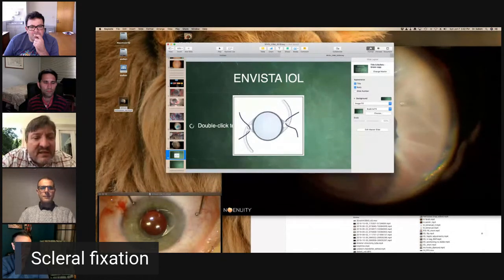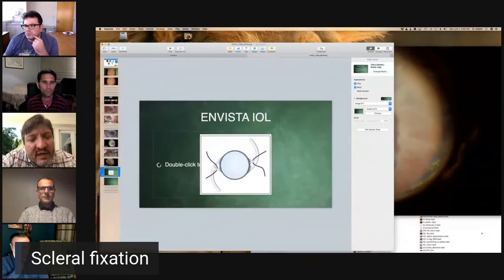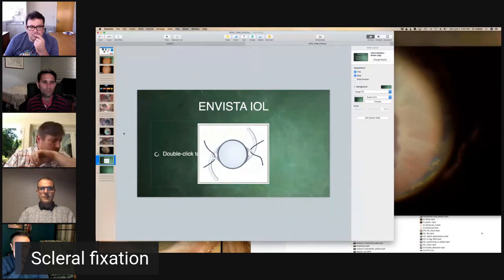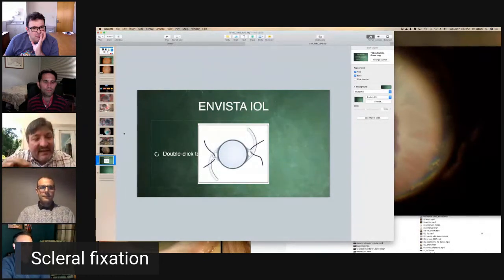But because this hole in the haptic insertion is so large, there's a neat little trick that you can do where you take a loop of Gore-Tex through that hole, open up the loop, put it over the end of the haptic, and then tighten it down. What that does is that moves the loop of the Gore-Tex to either side laterally of that very large eyelet at the haptic insertion, and that gives you a type of 4 point fixation. That'll get the lens to untilt.